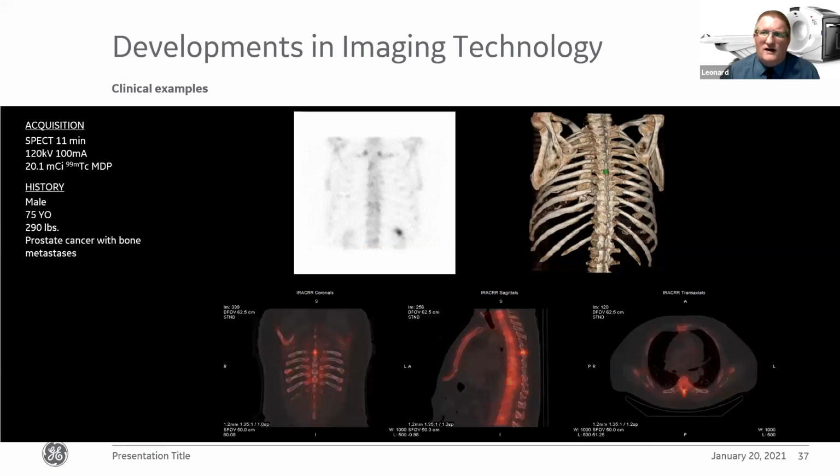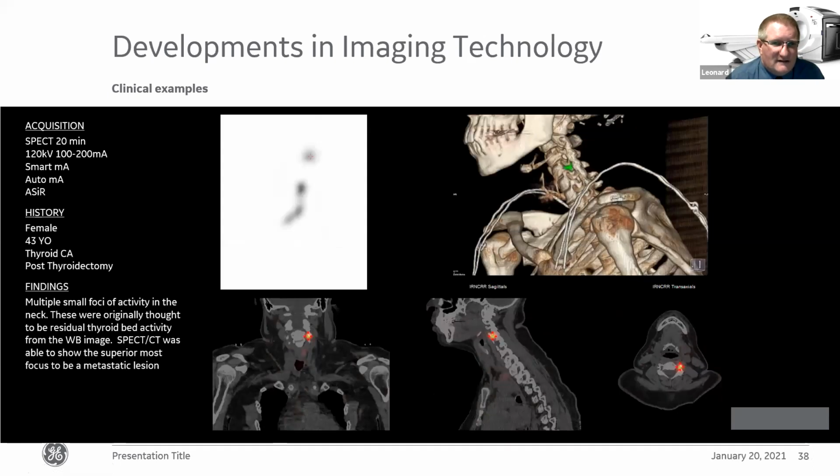And that has led us to where we are with some of the current technology and the capabilities of looking at some of these scans. We're seeing some very, very early lesions down here as we're doing a review. But we've also got a capability to segment and review these and see them in a spinning format, as you can see here. And again, we can get a 3D map, and this will show you here with the green uptake where this lesion's lying. So in terms of enabling the referring physicians, whether that's a surgeon, oncologist or whoever, we can now adapt and change their management and ultimately provide a better response for the patients and a better experience through the imaging process itself. And that extends to all sorts of areas as we're going through.